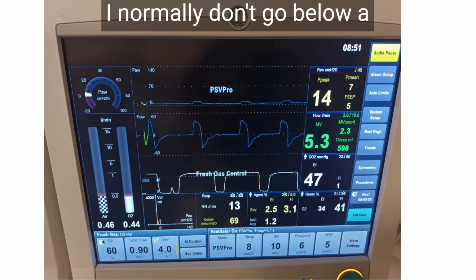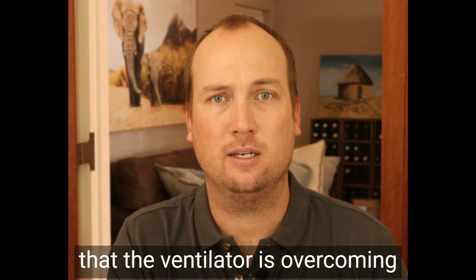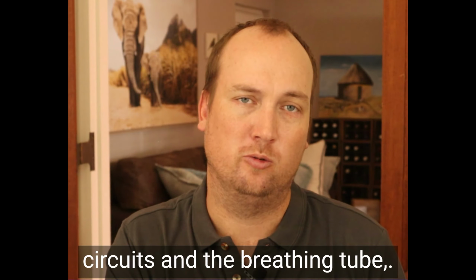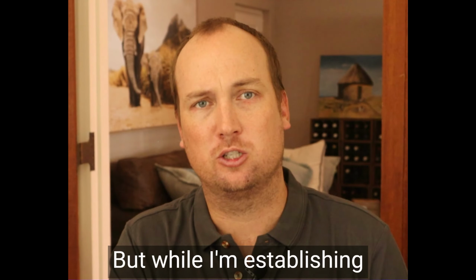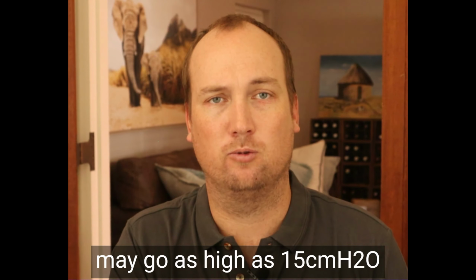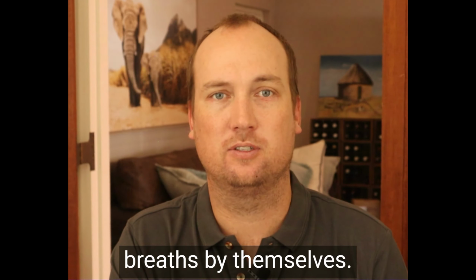I normally don't go below a pressure support of 6 centimeters of water because I want to make sure that the ventilator is overcoming the resistance of the breathing circuit and the breathing tube, and the patient isn't having to work against those resistances. But while I'm establishing pressure support ventilation, I may go as high as 15 centimeters of water until the patient is taking adequately strong inspiratory breaths by themselves.